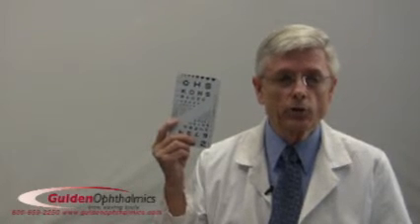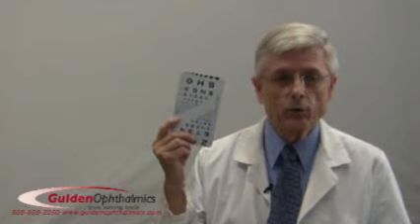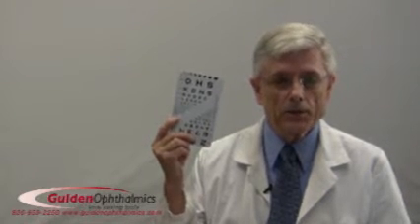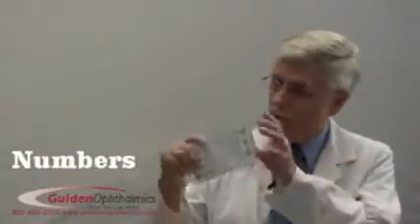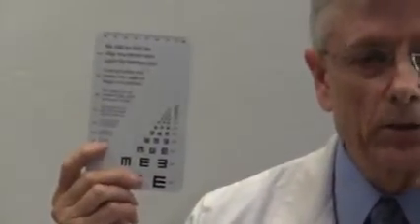The rows are marked in M notation and in 20-foot equivalent acuities. They are 20-foot equivalent acuities if the card is held at 40 centimeters, that is, 16 inches. There is a number chart on the other end of this card that you can use for very young children or illiterates. There's also on the other side a reading chart for assessment of reading ability.